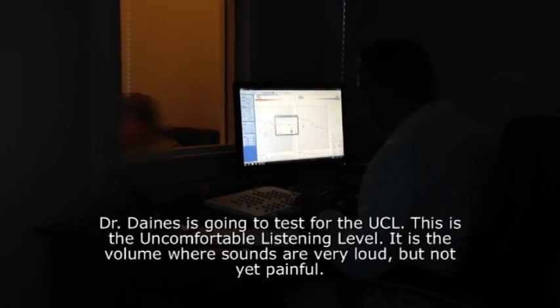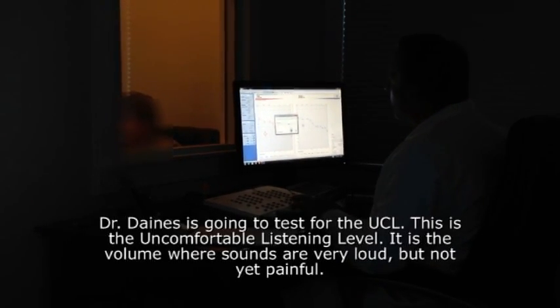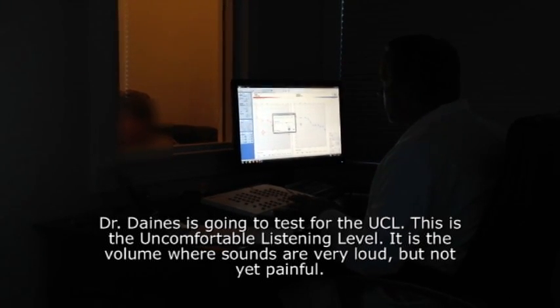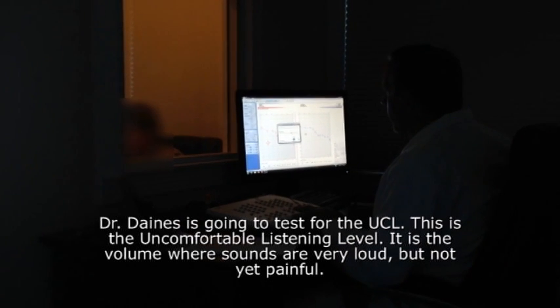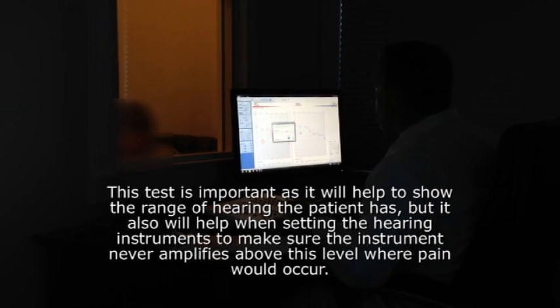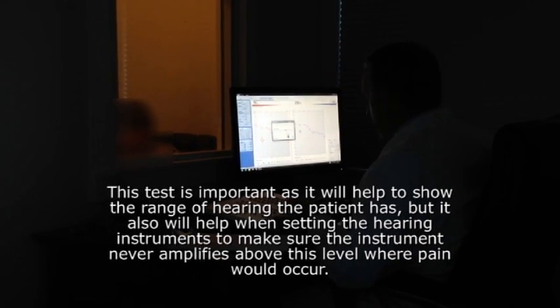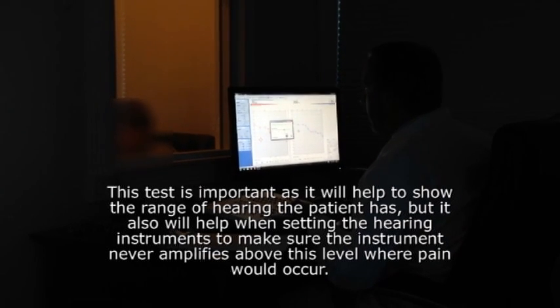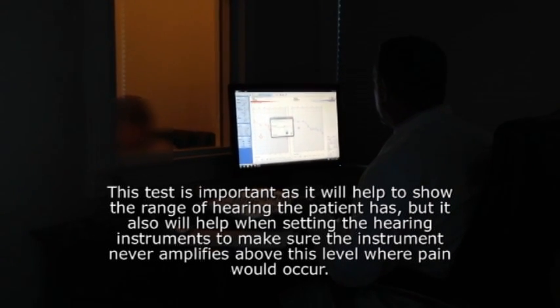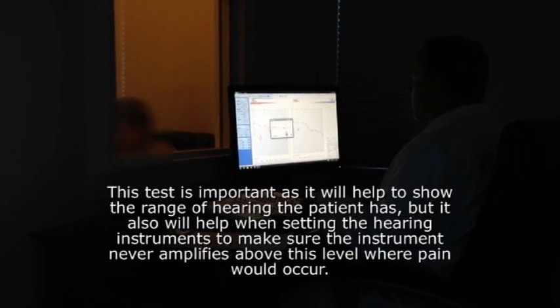Okay, for this test, this is where we want to find out where sounds become too loud to you. So I'm going to play some more beeps to you, and I'm going to turn the volume level up. When I reach a level that is just too loud, tell me to stop. You don't need to push the button, just say stop. Now I don't want it to be painfully loud, but I want it to be uncomfortably loud. So just say stop when I reach that point that is just too loud. We'll start with your right ear first.